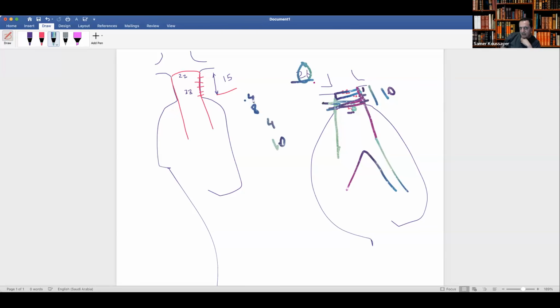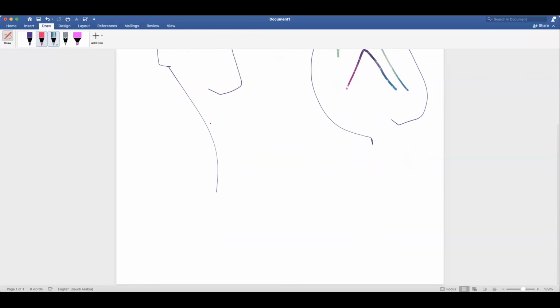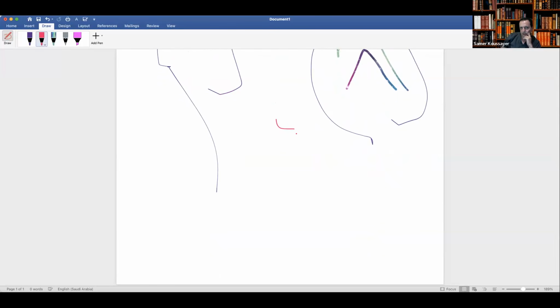If it's still less than 26, you are in the sealing zone. After 10 millimeters, if the neck is more than 26, it's not a sealing zone. Then you don't have 10 millimeters. Okay? Yes. And this takes me to the third one, which is like that. You understand better now, you see?